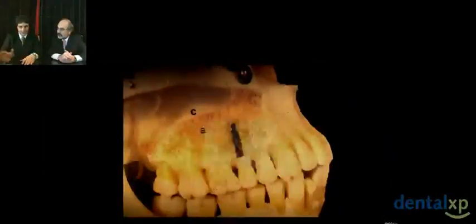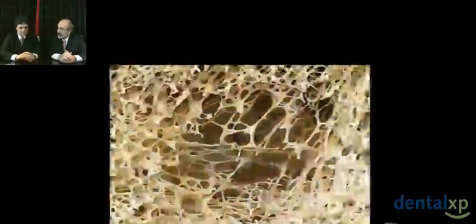This picture shows you histologically and with micro-CT how much connection you can have immediately after placement. These histologic slides were taken from implants not healed, just placed into the bone and sectioned. So you're looking at the bone implant interface. Now this is percentage. But if you go in a bone like this, for example, in the upper maxilla, in the upper jaw, then this is what you can get.